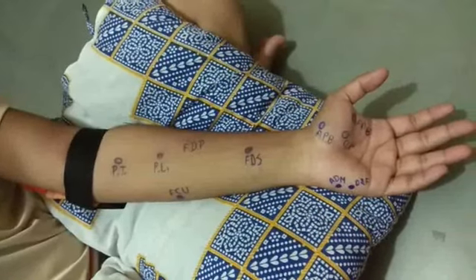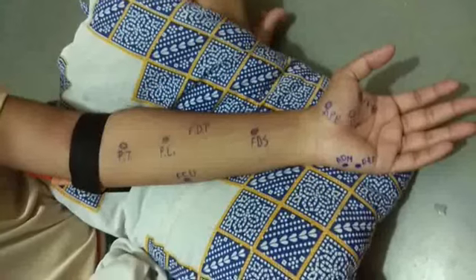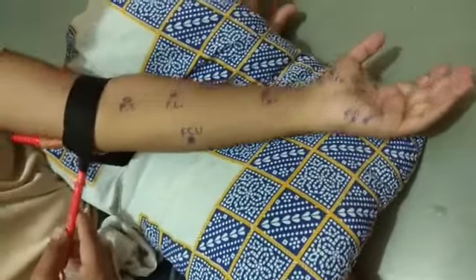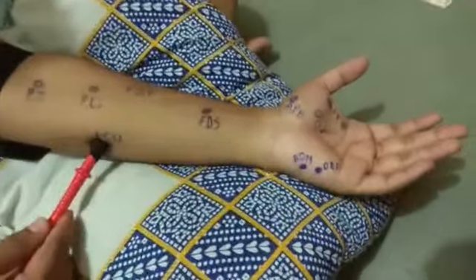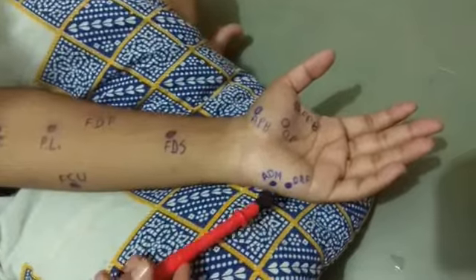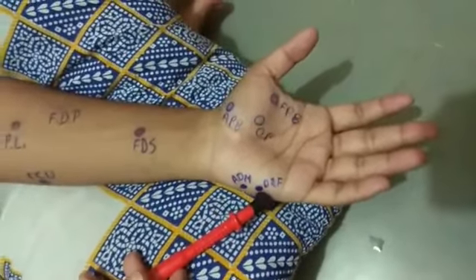Ulnar nerve. For the ulnar nerve, we can put the reference electrode behind the medial epicondyle of the humerus. There are three muscles supplied by the ulnar nerve: flexor carpi ulnaris, abductor digiti minimi, opponens and flexor digiti minimi.